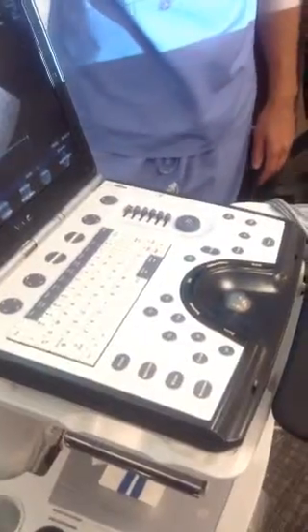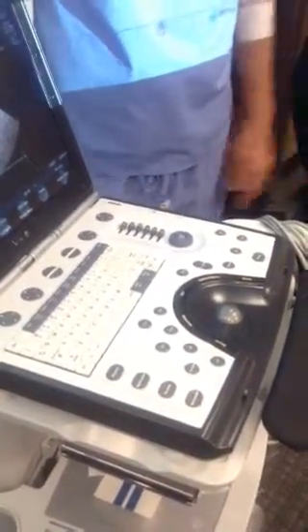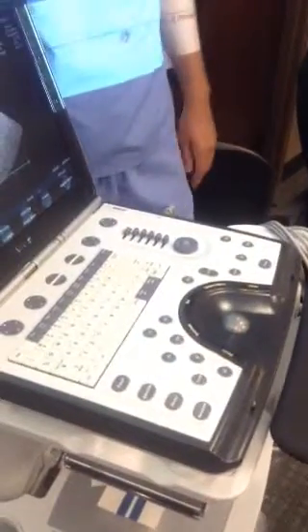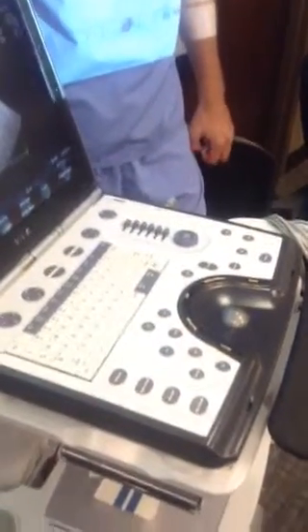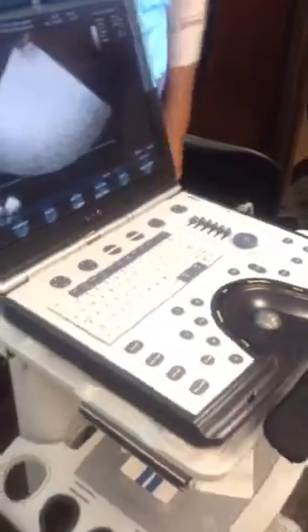So it's quantity, not quality? Well, when you're starting, great. Yeah. It's 2 o'clock in the morning, yes. It's quantity. You want to actually have. Put a couple of your own heart in there.